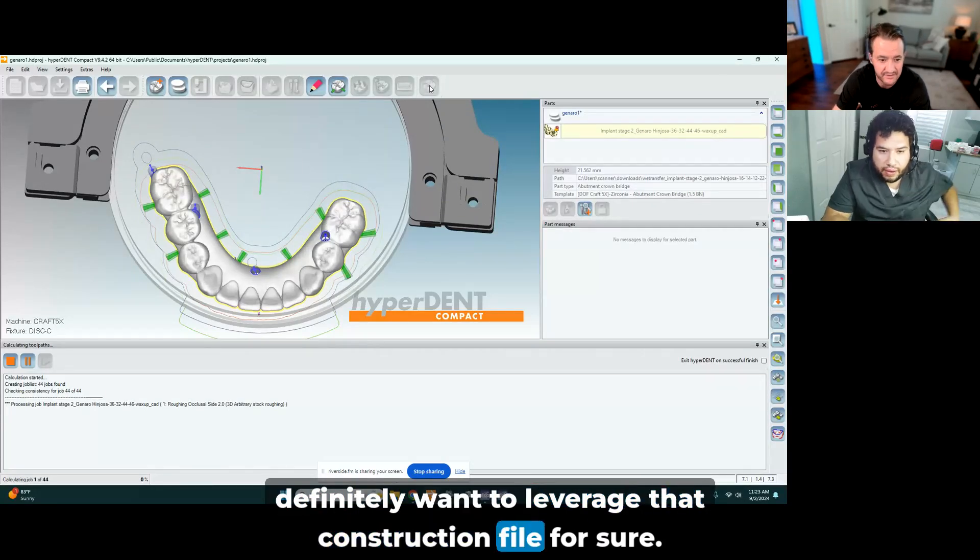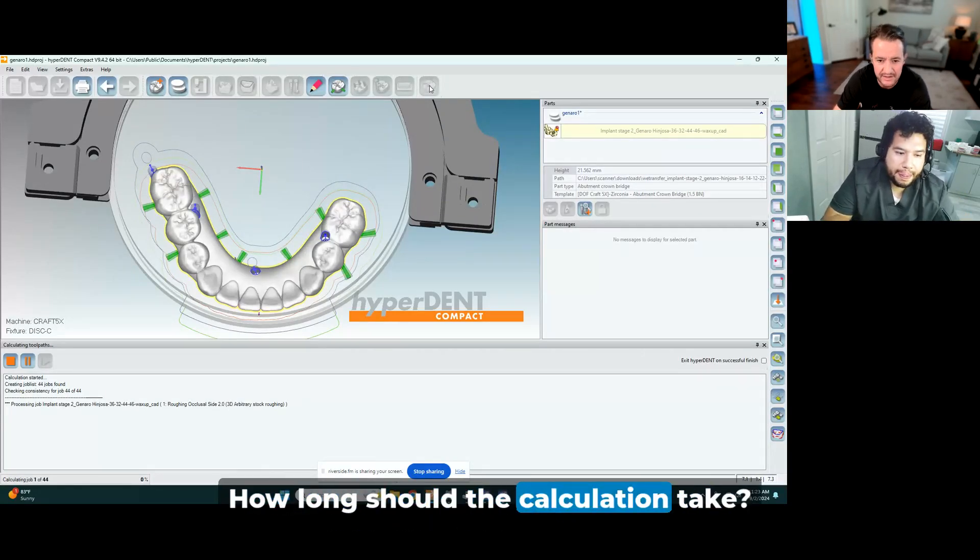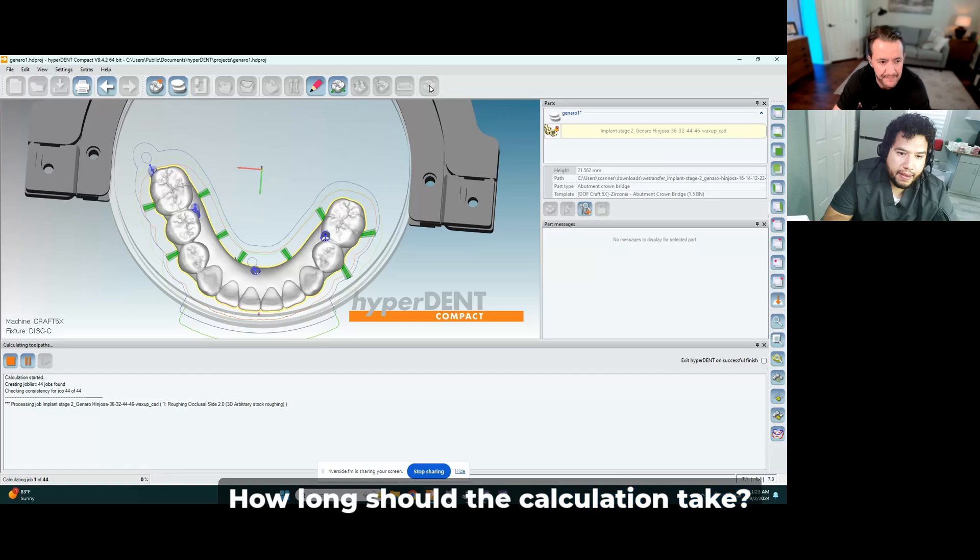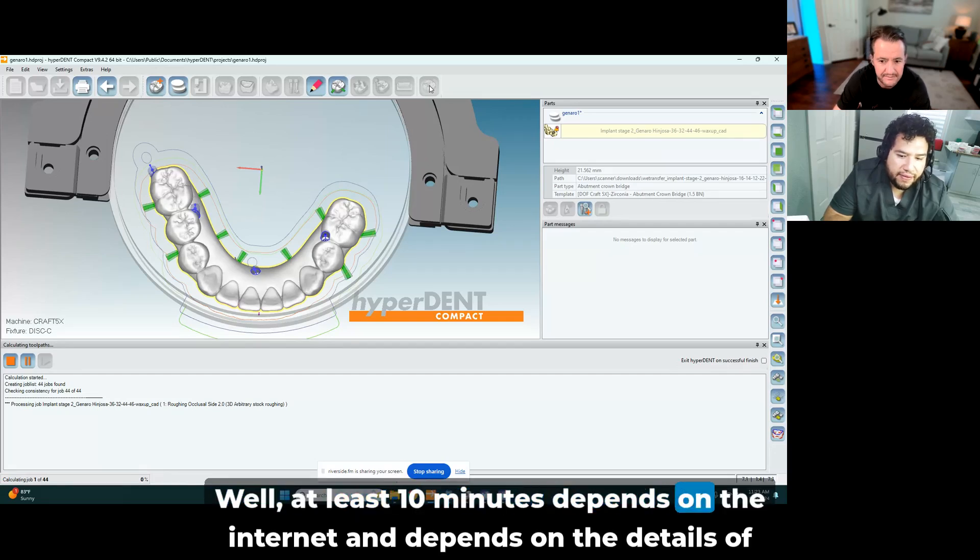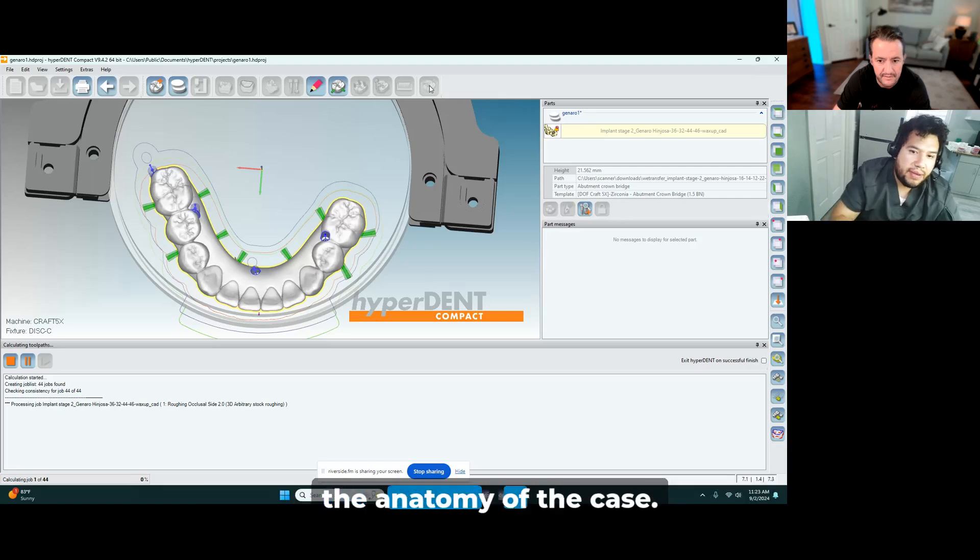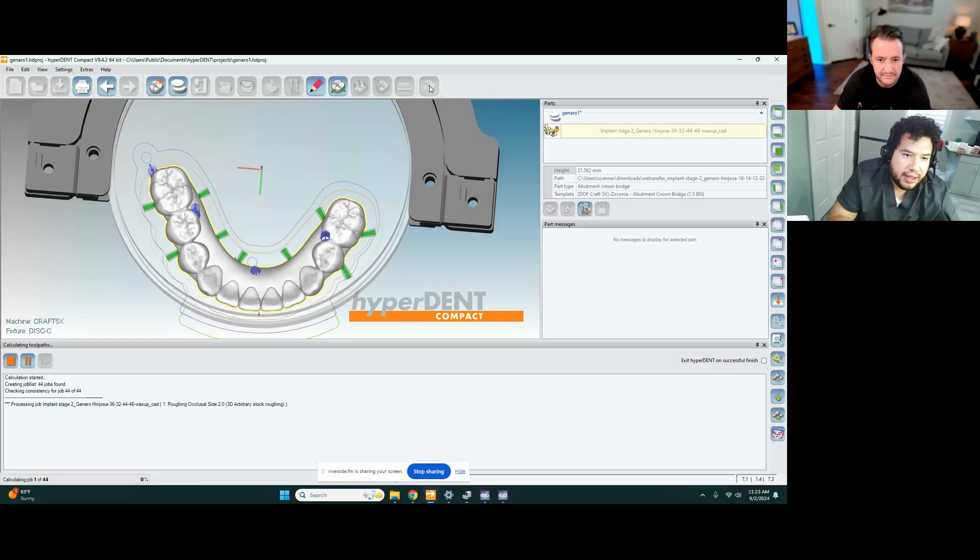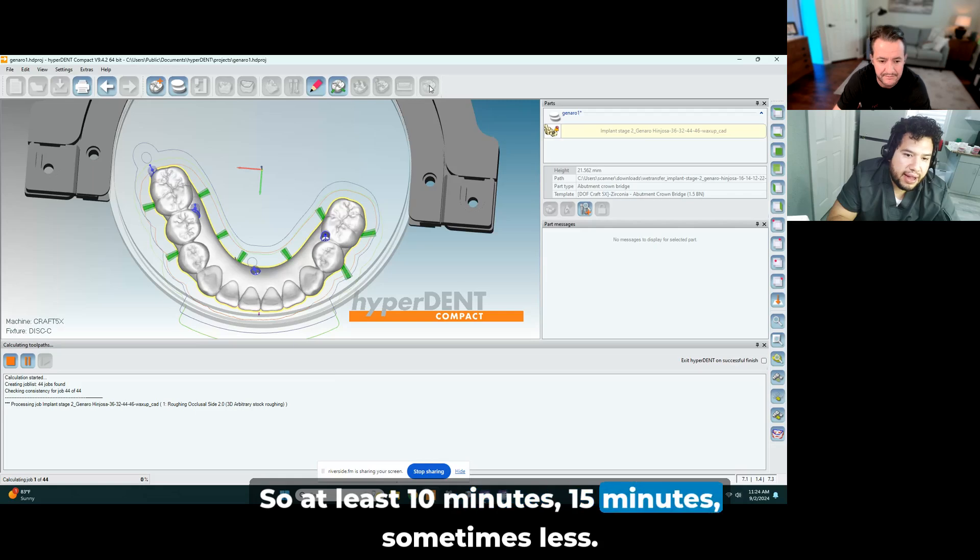How long should the calculation take? At least 10 minutes, depends on the internet and depends on the details of the anatomy of the case. Okay, so at least 15, 10 minutes, 15 minutes, sometimes less.